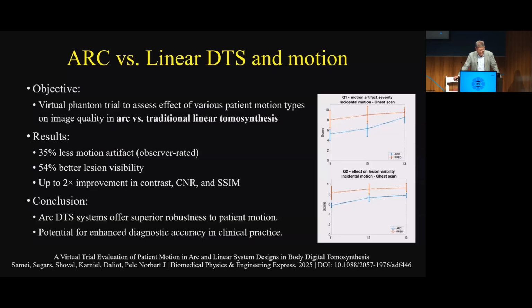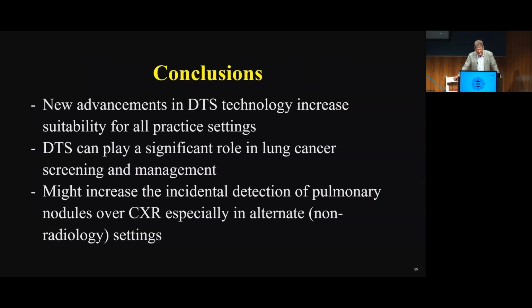So, the bottom line is this is a technology that is available. It is now more practical and lower cost than it's ever been beforehand. It could potentially play a role in lung cancer screening and management, and it might increase the incidental detection of pulmonary nodules over chest X-rays, especially in alternative non-radiology settings.